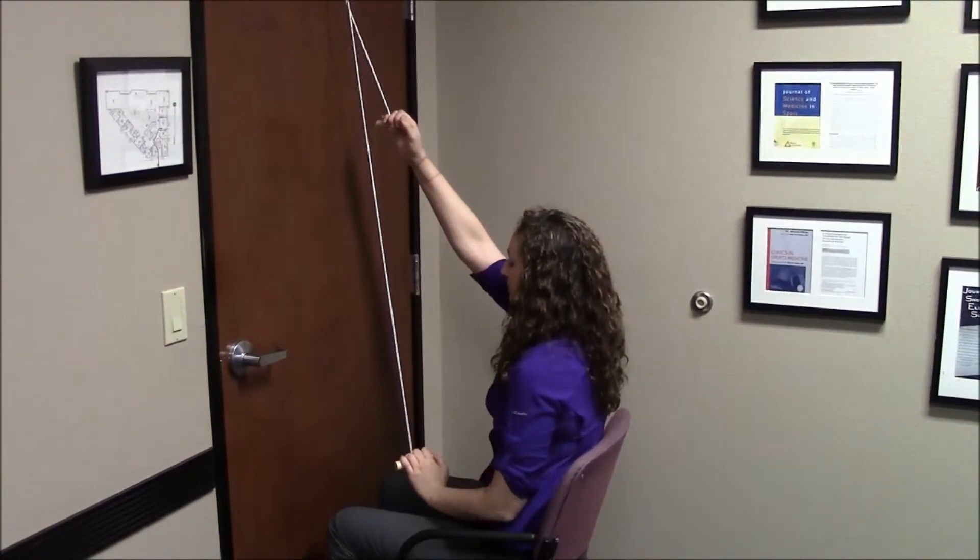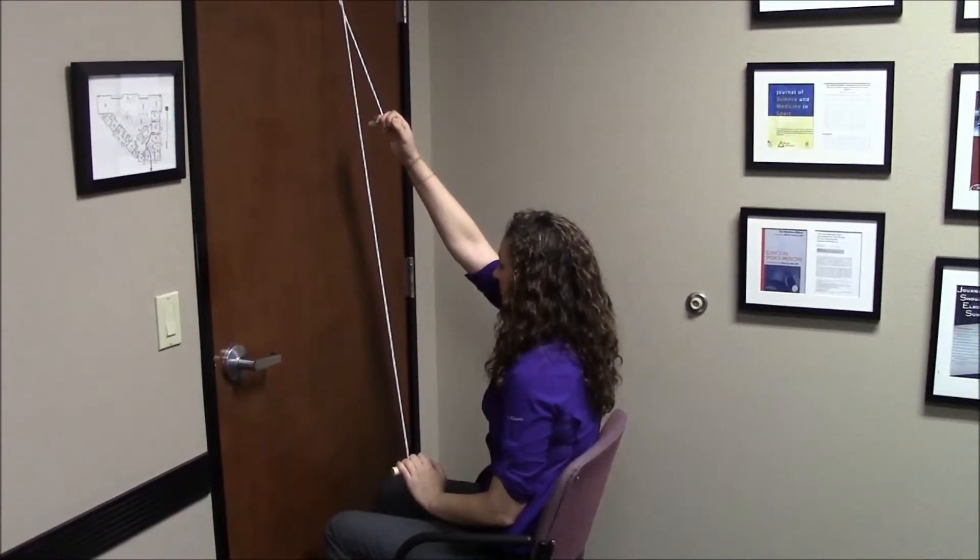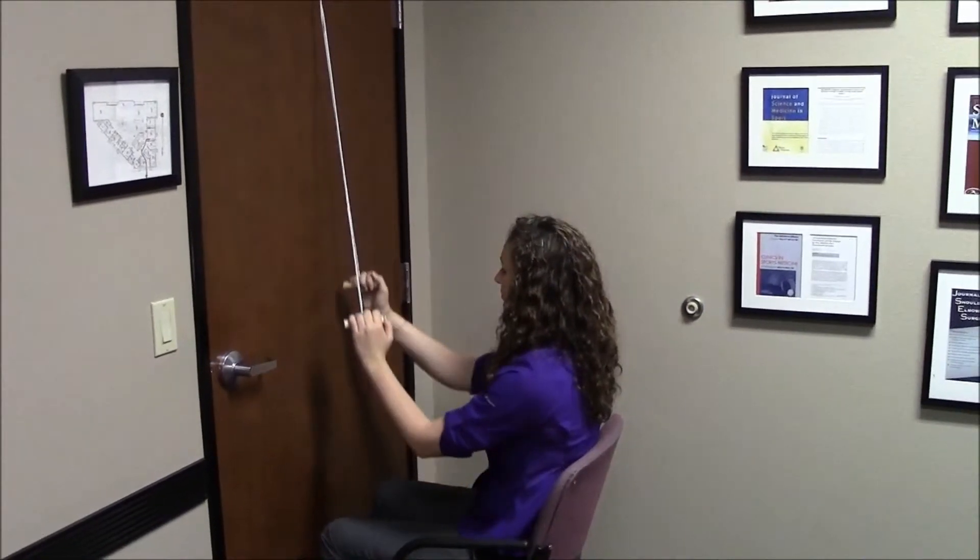To start the pulley exercise, face towards the door, securing the pulley safely on the top of the door.